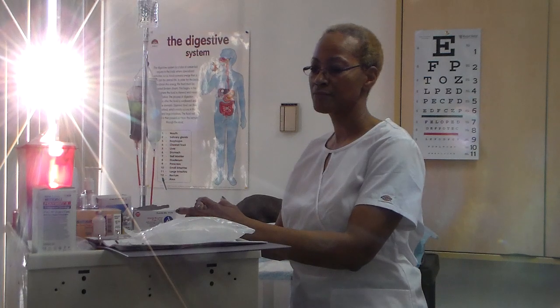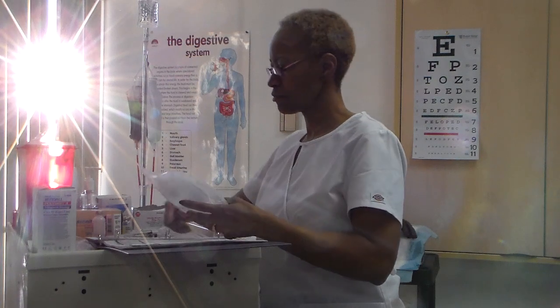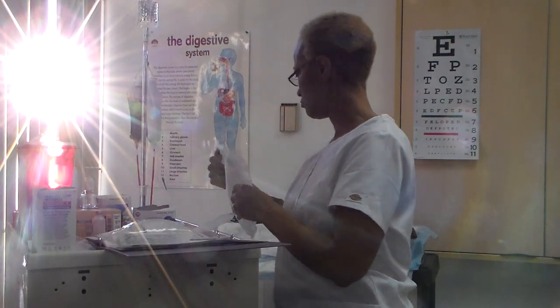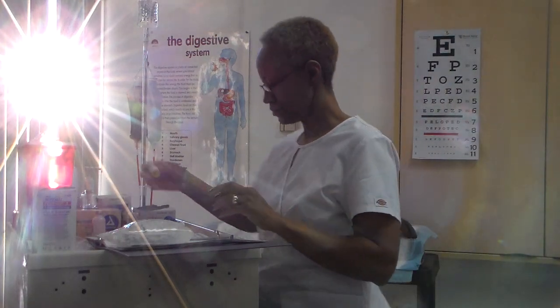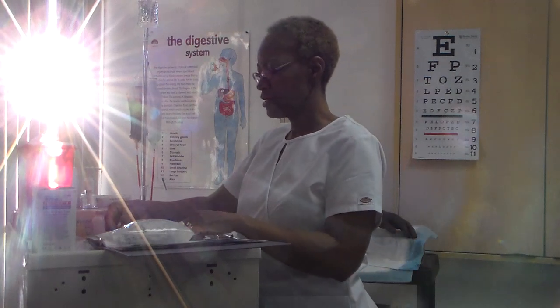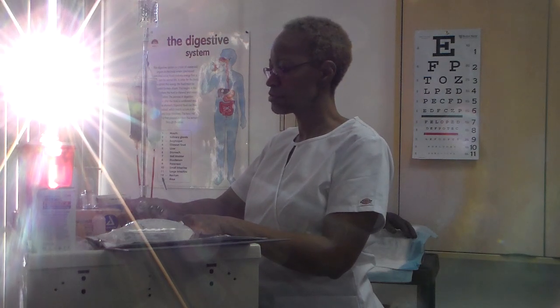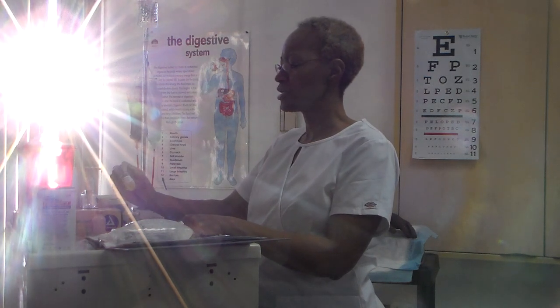Prepare medication. Use aseptic technique. Be sure to compare the label of the medication with the MAR 2 times while preparing the medication. First check. So I get my medication, I take it out of the drawer, and then I check it against my MAR. That's my first check. Making sure I look at expiration date. Expires June 2016. I look at the medication. It's clear. It's not cloudy. There's no sedimentations in it.